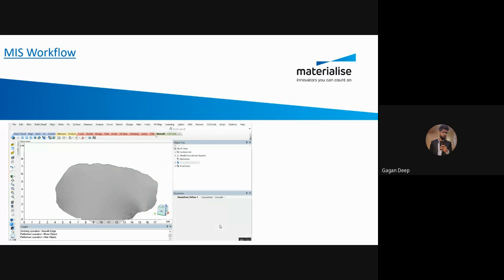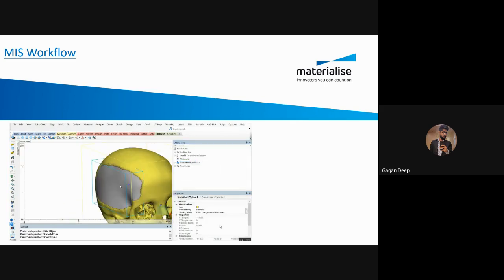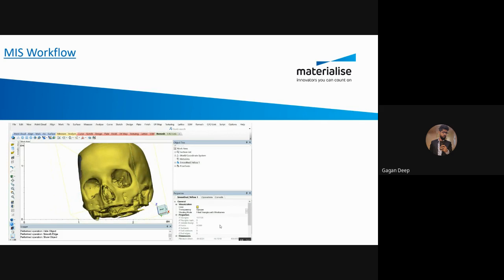Now the next part is to smooth the edges, because we are going to print this in Ti6Al4V, that is, titanium metal printing. So the edges should be smooth, and those operations can also be done here. Once you are happy with the model, you can directly export the file as a 3D STL, import it in the 3D printing software, and directly print it.